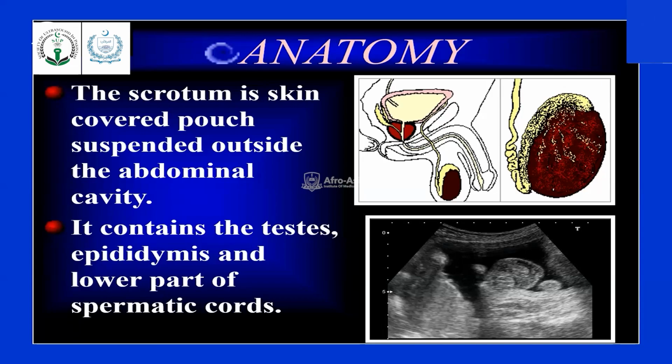Before we go to the ultrasound of scrotum, testicles, and other structures in the scrotum, let's see the anatomy. Scrotum is a skin-covered pouch suspended outside the abdominal cavity. It contains the testes, epididymis, and lower part of the spermatic cord.